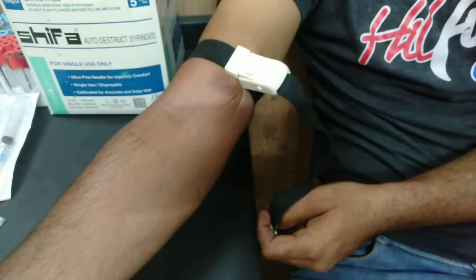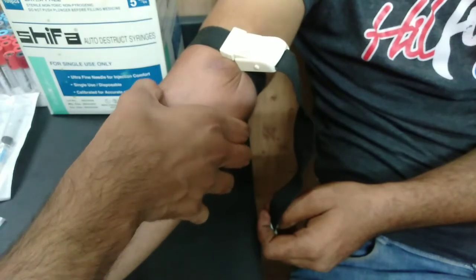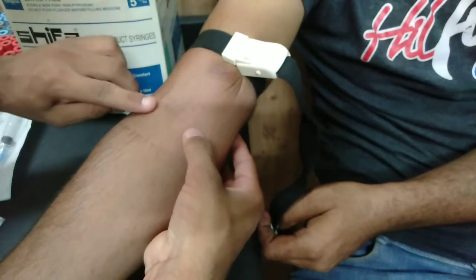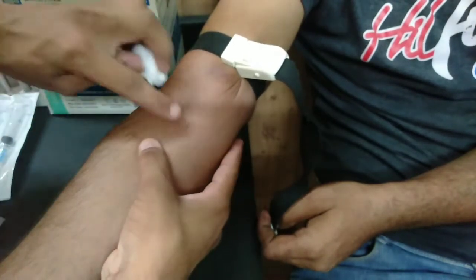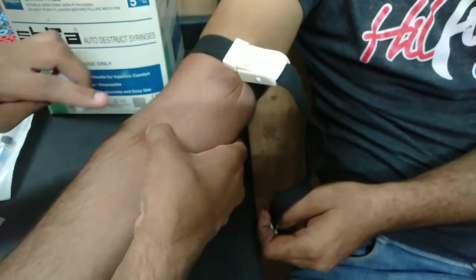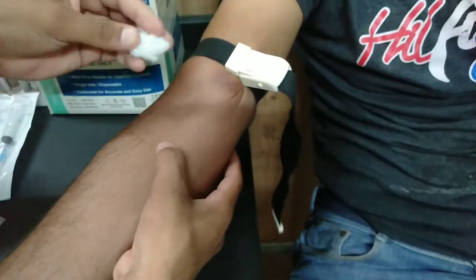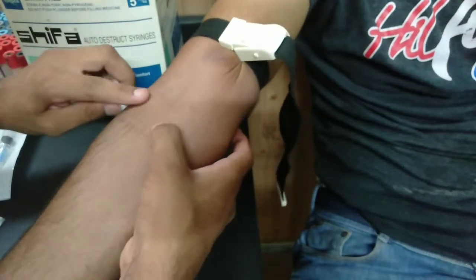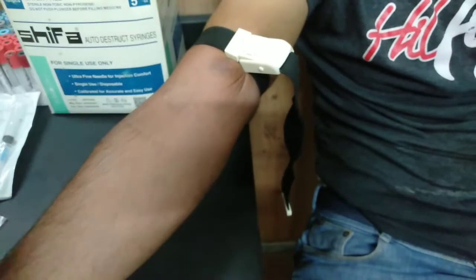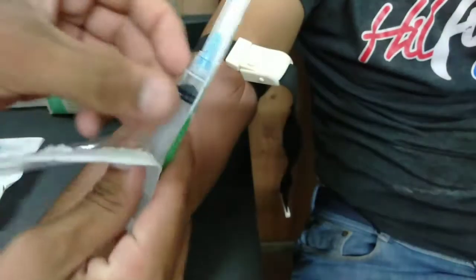We have to open the syringes and detect the vein. I have a cephalic vein here. If we don't get the vein, we can say that we need to close the tourniquet. After that, we will open the syringes. The syringes are open.